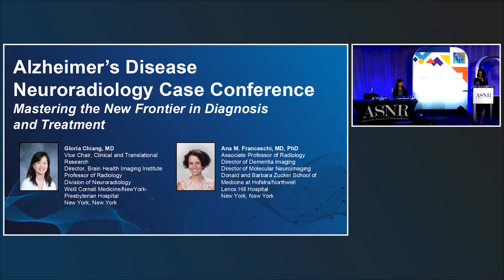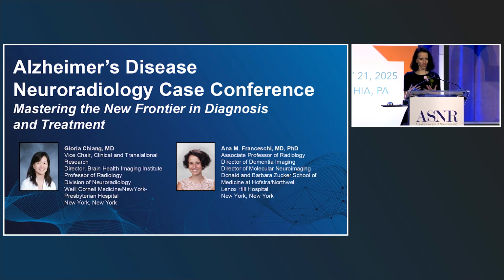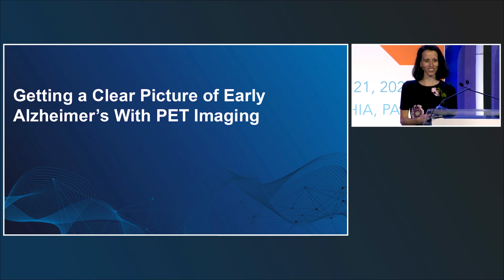Hi, everyone. Good afternoon. Dr. Chiang and I will be presenting this Alzheimer's Disease Neuroradiology Case Conference. I'll start with an overview and focus on molecular imaging and specifically amyloid PET in clinical practice. And then Gloria will take over and discuss ARIA management and treatment monitoring. I think we can go ahead and get started.